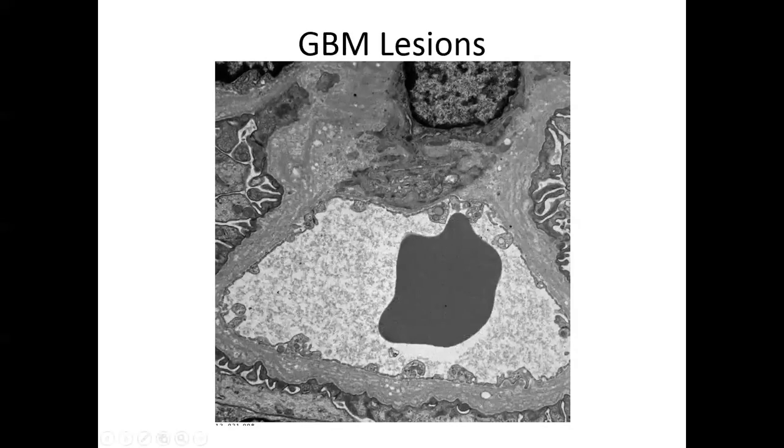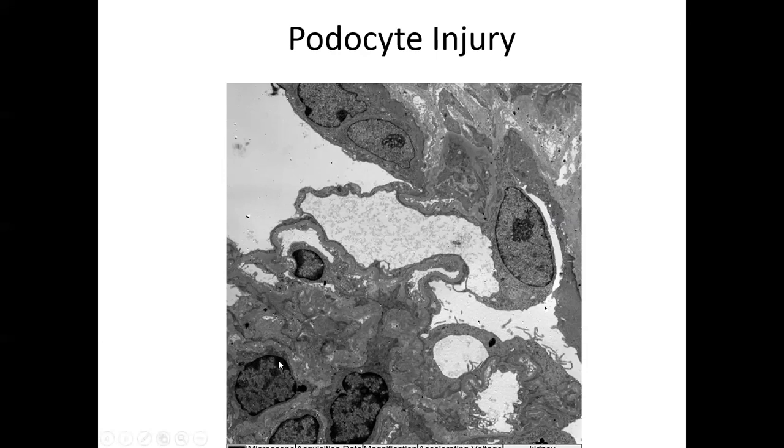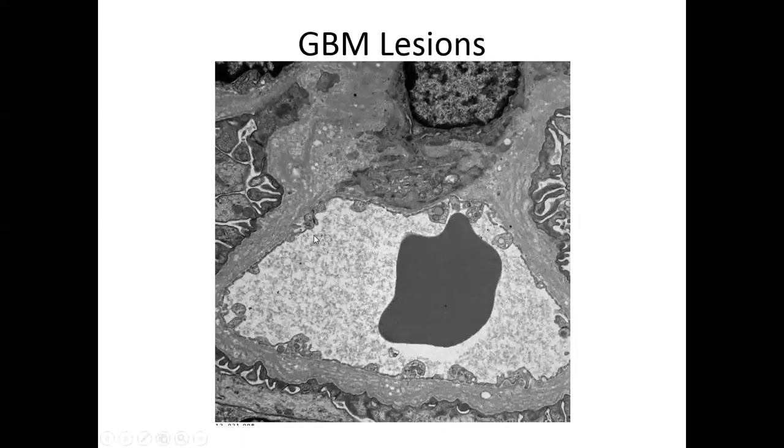And then as Dr. Clark presented at ACVP, you can have abnormalities in your glomerular basement membrane. This particular dog is a very small breed dog, and you have all these different laminations of your glomerular basement membrane. It is not just a dense, normal, uniform, characteristic GBM. It has multi-laminations, and these dogs are proteinuric, and they don't have evidence of underlying immune complex deposition.